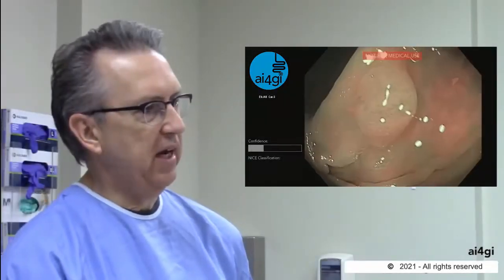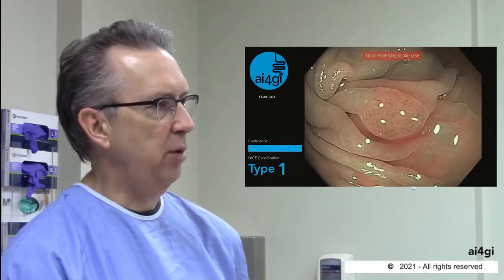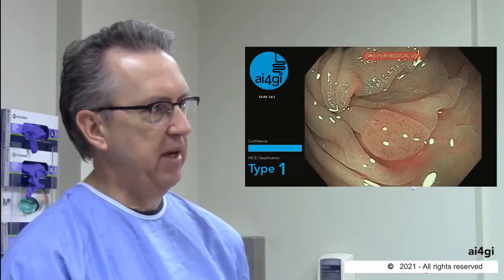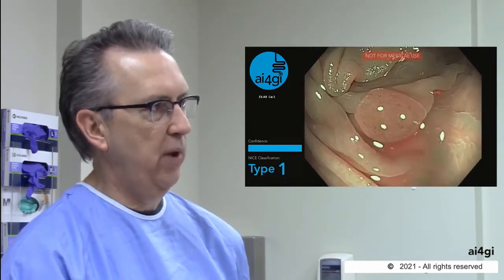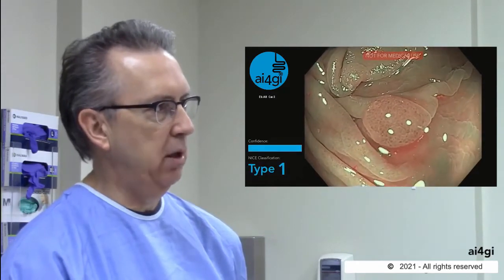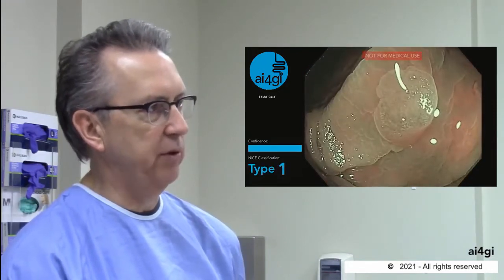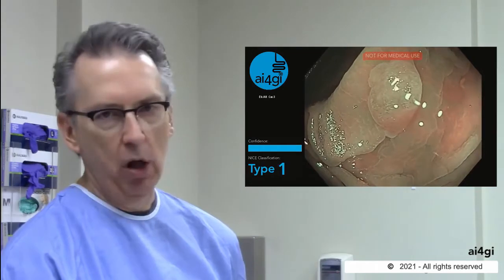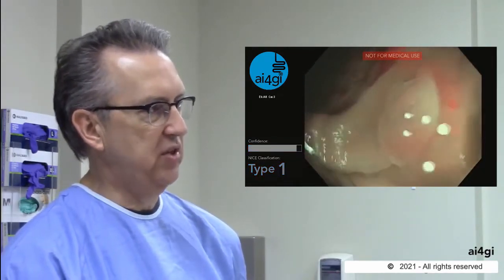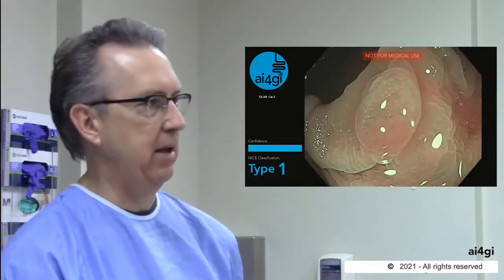In the same rectum, we can see a couple of other lesions here and here. These are a little bit more typical type 1 lesions for both of these, and the program is immediately recognizing that these are type 1. Some of these pits are a little bit more open on the lower lesion — I probably would remove that. On the other hand, I'd feel completely comfortable leaving this lesion in the rectum, especially if it were 5 millimeters or smaller. It's good to see the endoscopic assessment confirmed by the AI program.